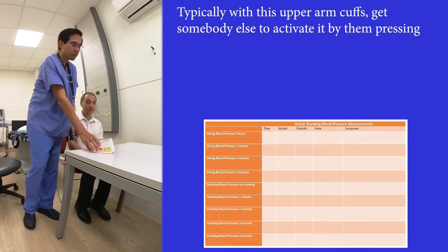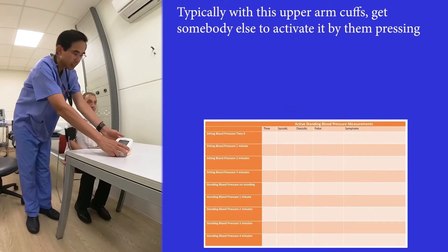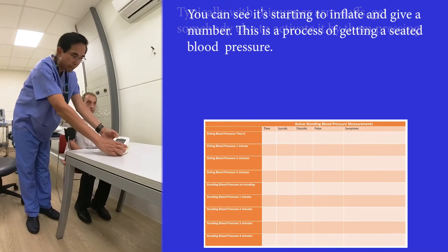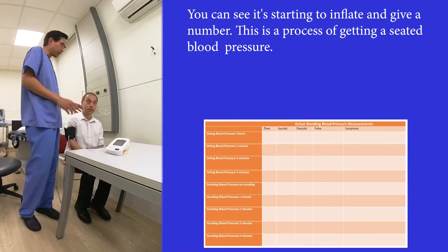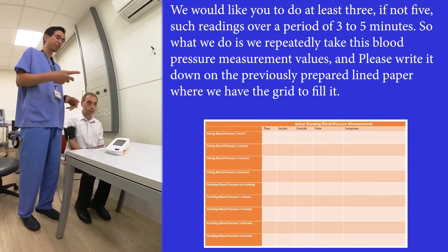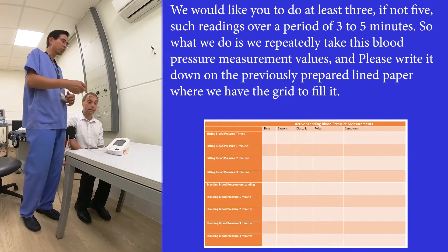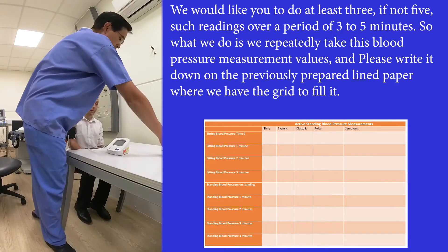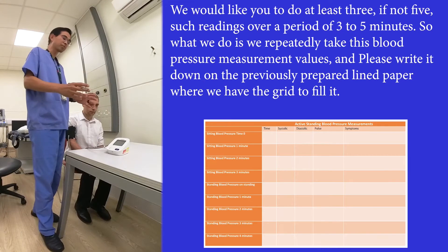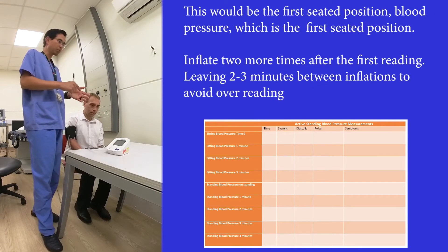With this upper arm cuff, ideally somebody else is pressing the button so Phil doesn't have to move his hand to reach out. You can see it's starting to inflate and give a number. This is the process of getting a seated blood pressure, and we'd like you to do at least three, if not five, such readings over a period of three to five minutes. We write it down on the prepared sheet with the grid — this is BP1, seated position.